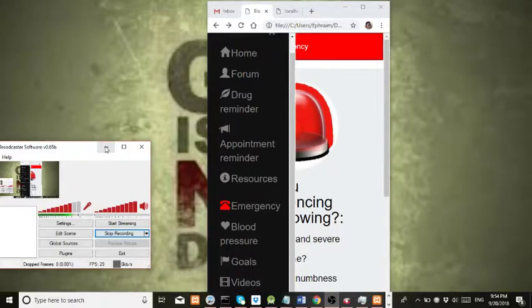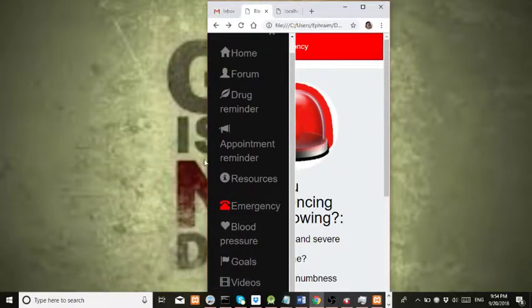So in this section, we are going to explore how to record blood pressure measurements. One key thing which is important during reviews, especially for patients that have hypertension, is the readjusting of the dosage of medicine.